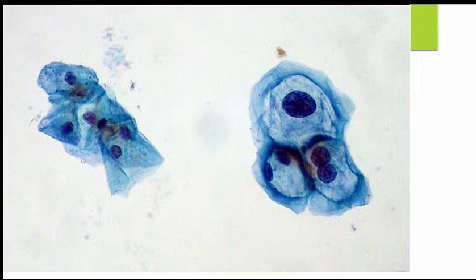And I just thought this was a better picture of what a typical koilocyte looks like. Again, on the left, we have our normal intermediate cells, and we use the nuclei of the intermediate cells to compare for size in cytology. And on the right, we can clearly see that this nucleus is at least four times greater than the one on the left. We have this cleared-out space, which is the halo formation caused by the presence of HPV. And in this lower cell in this group, you can see two nuclei, which you shouldn't see. That binucleation is another common finding with LSIL as well.